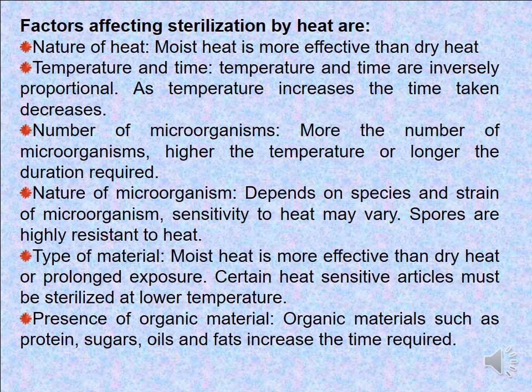The type of material that is used for surgical purposes. Moist heat is more effective than dry heat or prolonged exposure. Certain heat-sensitive articles must be sterilized at lower temperature.